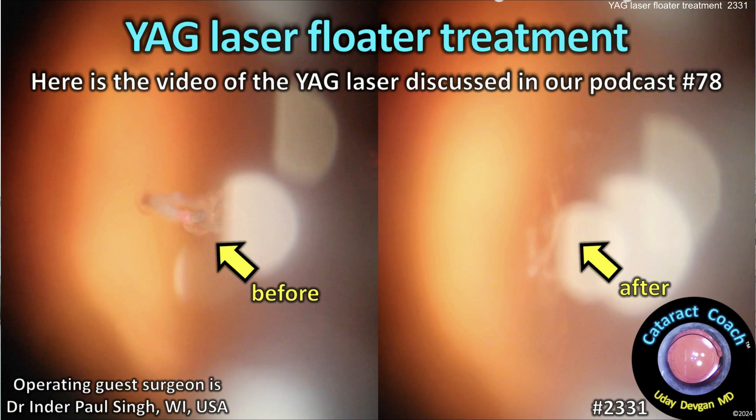cataractcoach.com — YAG laser treatment for vitreous floaters. This could be something. We all have patients who complain, often very bitterly, about the problems they have from their floaters, and typically we don't have a whole lot to offer. We all get vitreous opacities with age, we get a posterior vitreous detachment, a Weiss ring. Even I have a couple of floaters that bother me. But the question is: what can you do about them? Of course we can do a full vitrectomy to remove them, or we can do a YAG laser treatment.